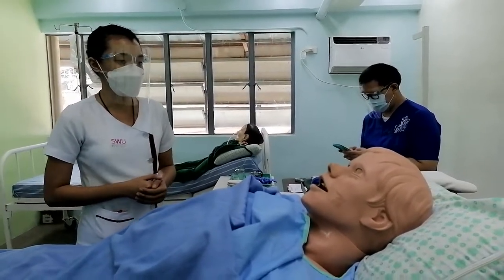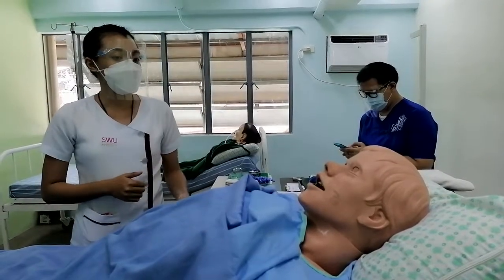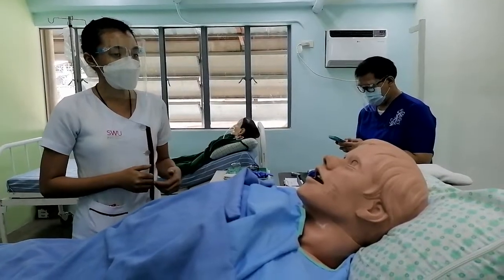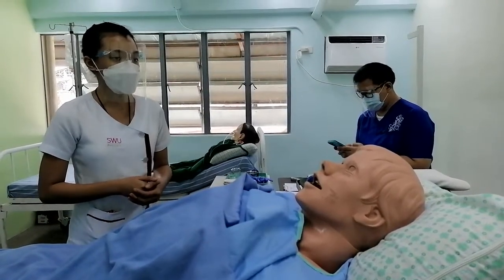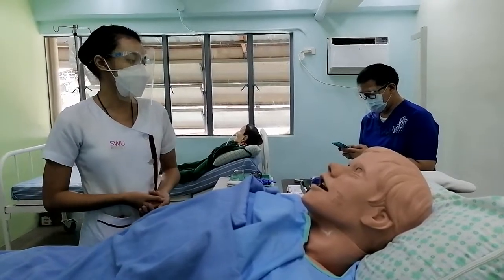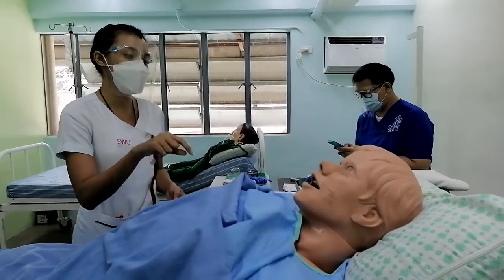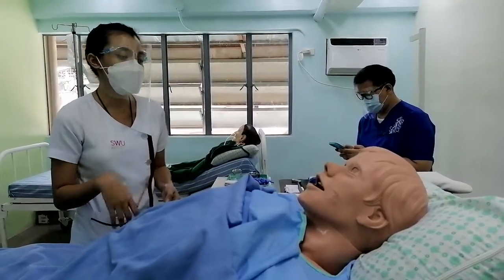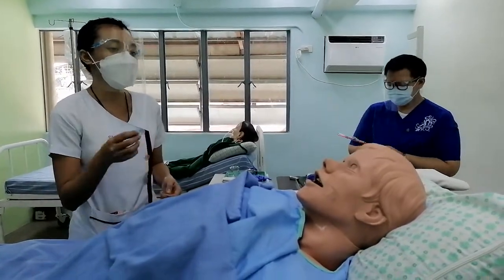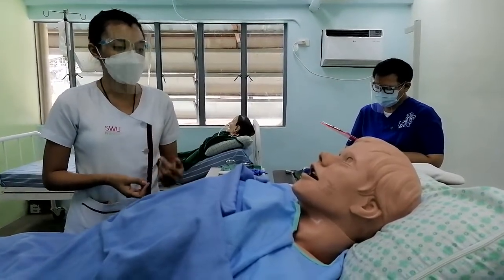Explaining the procedure to the patient is very essential because we are helping the patient exercise their right to be informed, and it also lessens their anxiety and promotes comfort and trust with the healthcare provider. So sir, today I will be inserting a tube through your nose, and it will go down to your esophagus and to your stomach. Say, for example, you have undergone an oral surgery, this will be an alternative way to ensure that you will still have your proper nutrition.